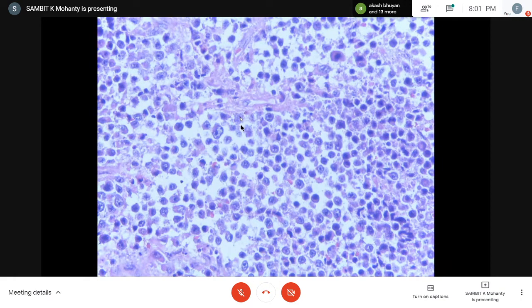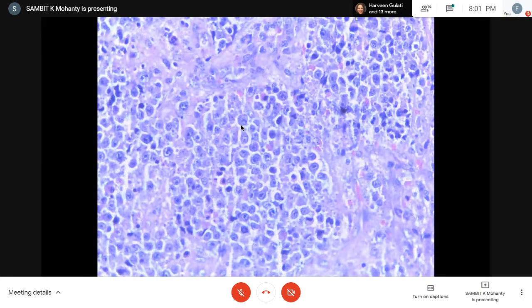They are intermediate to bigger cells, the majority having prominent nucleoli, some central and some eccentric. Some are attached to the nuclear membrane, with vesicular chromatin. Some look a little modified. There is brisk mitotic activity and apoptotic bodies. Cells with this packeting arrangement are also seen, and some pseudoacinar pattern was also seen.